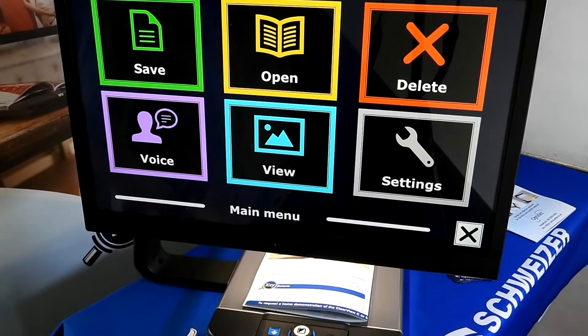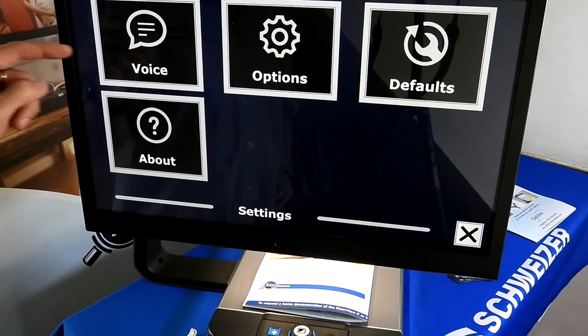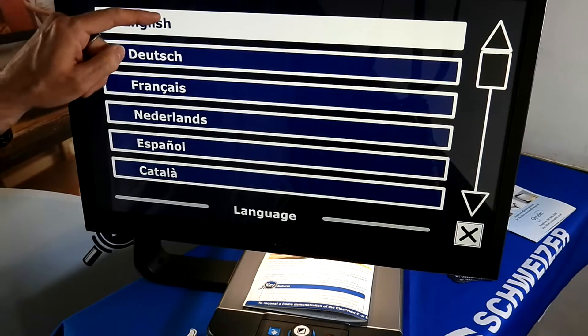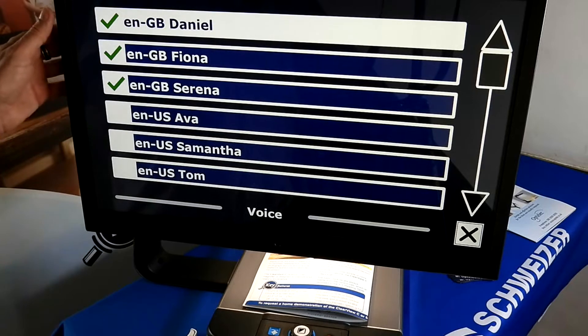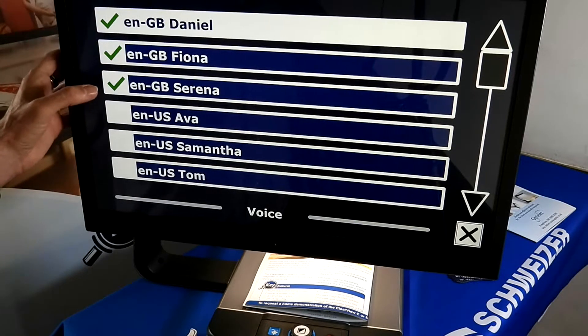By going into Settings, we have further options. Entering the language selection menu — it's set to English now. Going into English brings up the voice selection menu: British English Daniel is selected. Fiona and Serena are also pre-installed.